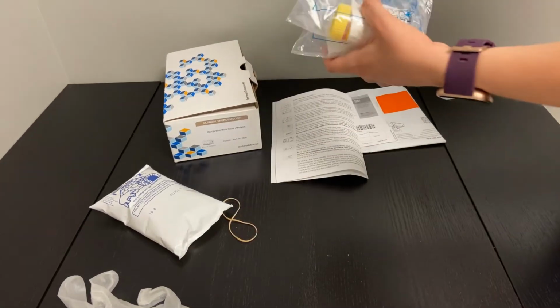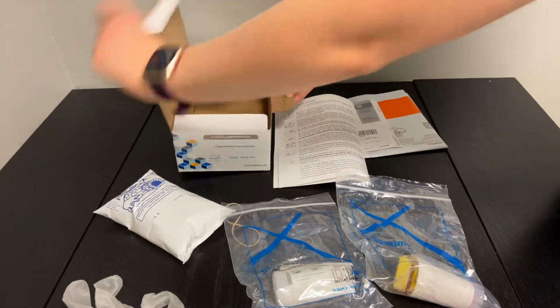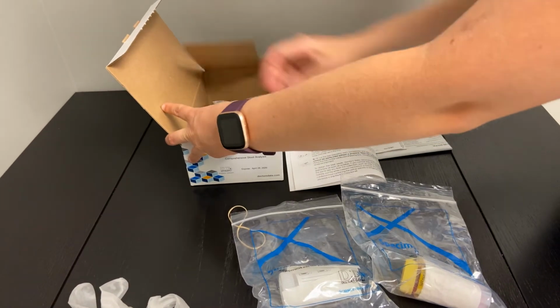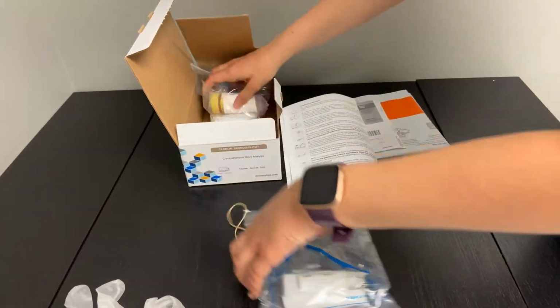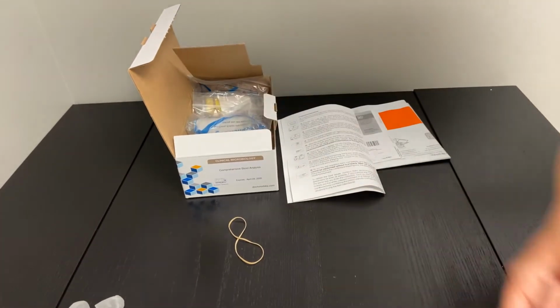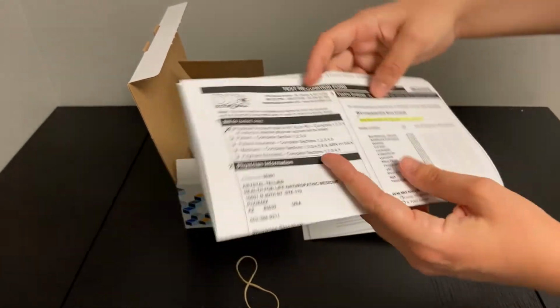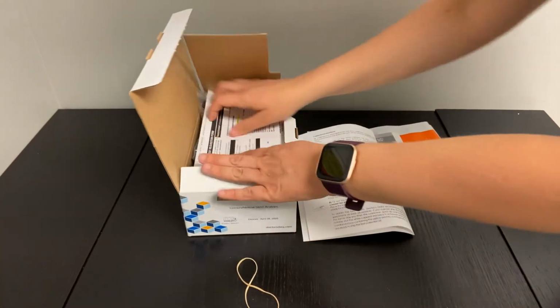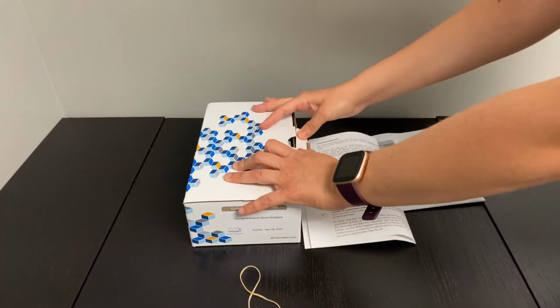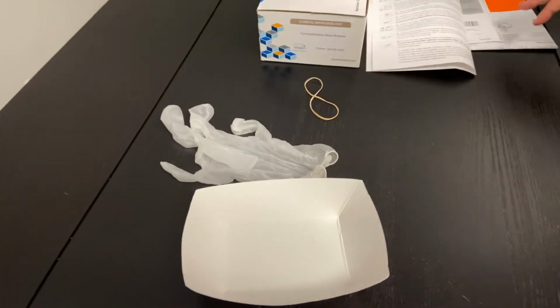These will then go into the freezer, and then the next day, what you'll do is you'll open up this box. You'll put this frozen ice pack that you had prepared from the day before, and put both of these samples just on here, just like that. You'll make sure that you had made a note here of the date the sample was collected, and then you'll slip this into this box just like so.